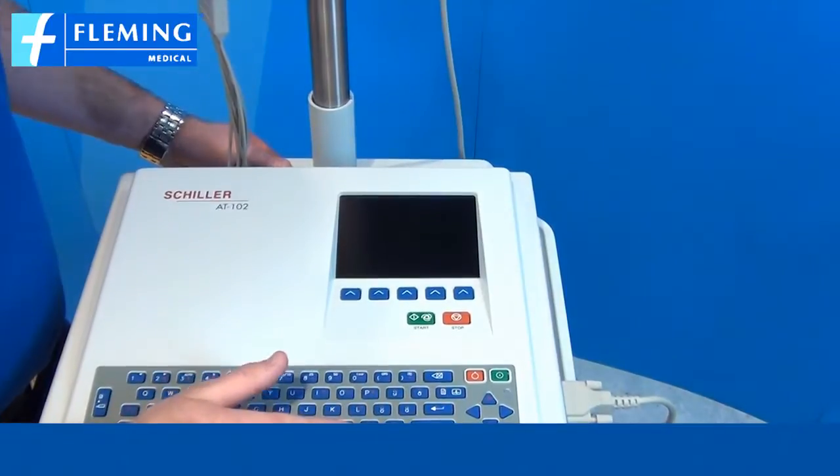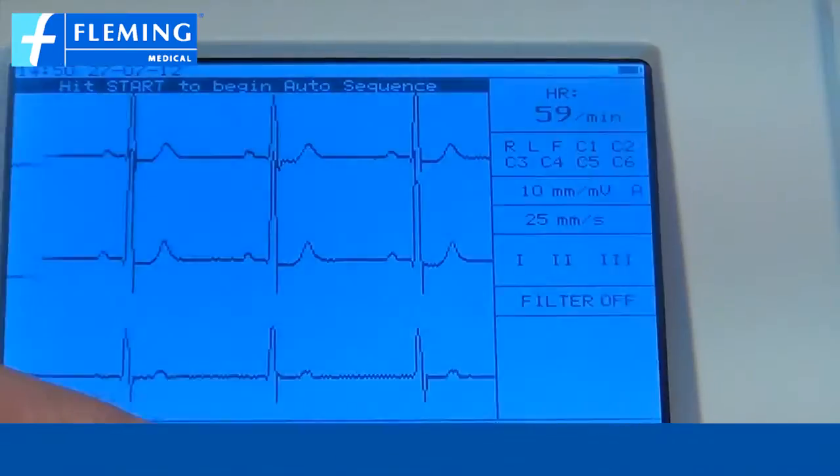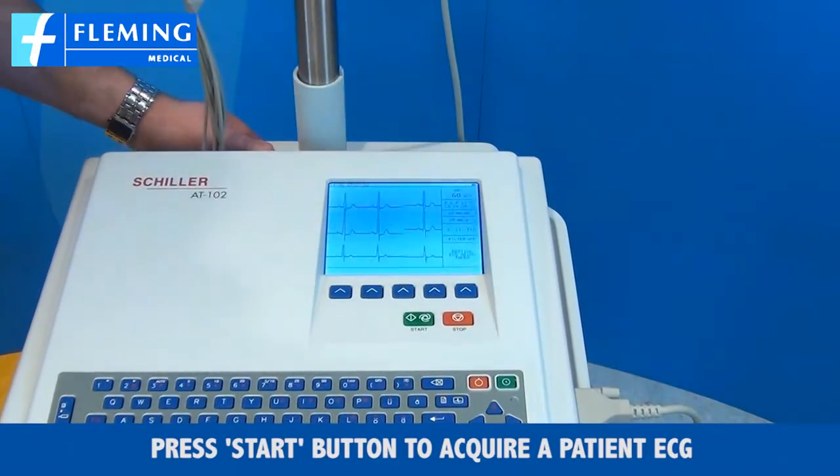To use the product we press the on button and we press the start button to acquire a patient ECG.